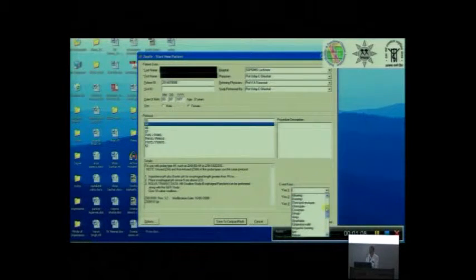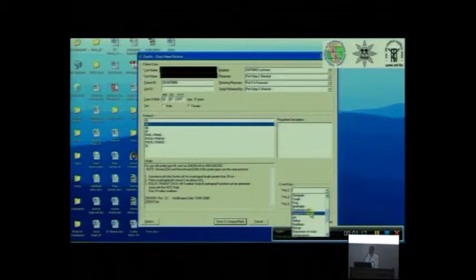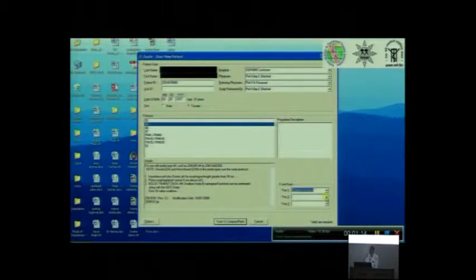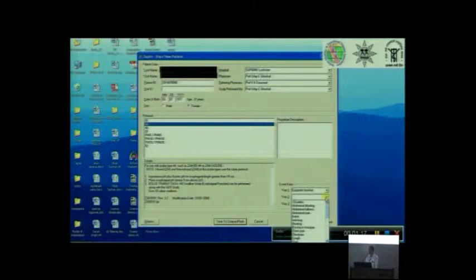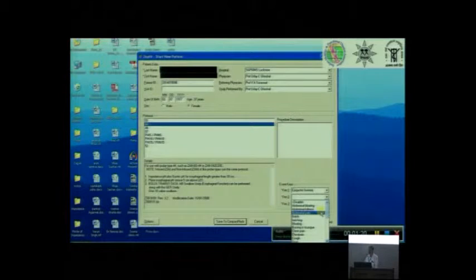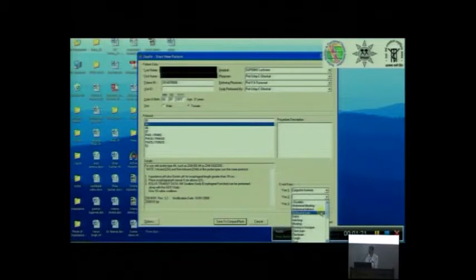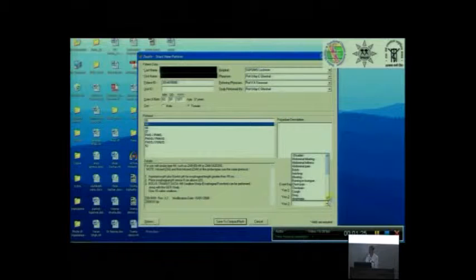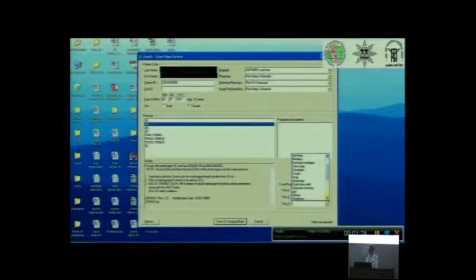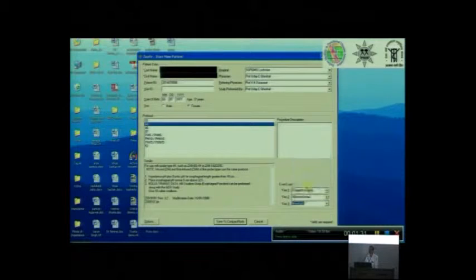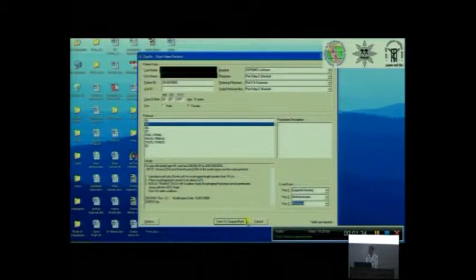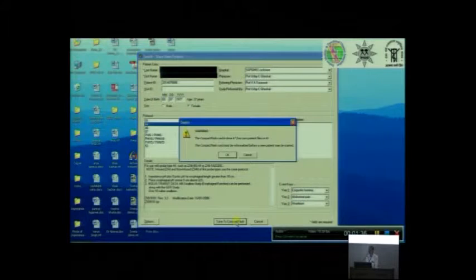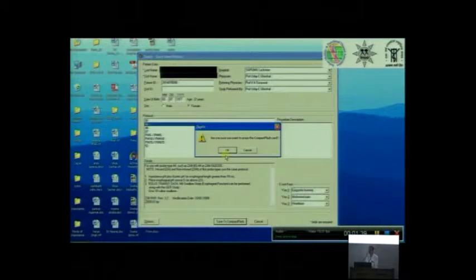Now on the right hand side you select the key. Why these keys are selected, I'll tell you. Like the patient during the procedure, if she has epigastric pain, will instruct her to actually press key number one, because in the system we have fed key number one means this is epigastric pain, and all this is being done in a chip. We remove the chip from the pH meter or data logger, put into computer where the software is there, and then you are doing all this.